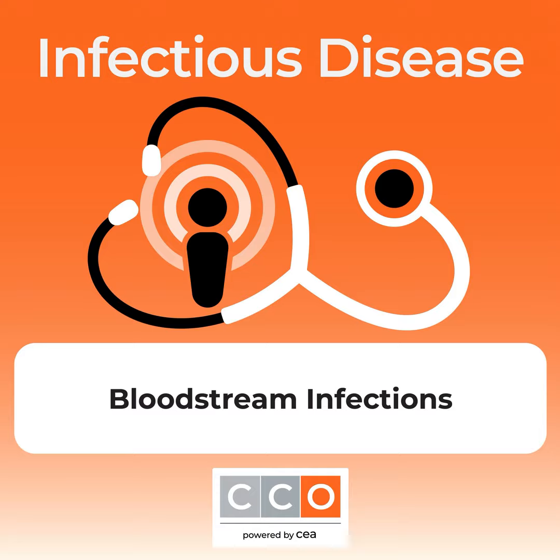So again, this technology involves the ionization of organism proteins followed by the measurement and comparison of their mass charge ratios against that of known organisms in this massive database. So the ability to detect over 400 pathogens in as little as a half an hour is something that we can achieve with MALDI-TOF, although it is unable to detect the presence or absence of specific resistance genes.